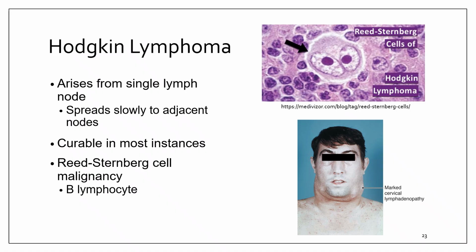Let's zoom in on that histology image. Reed-Sternberg cells are very large, often binucleated or multinucleated, and have prominent nucleoli. Classic appearance is owl eyes. Once you see them, you never unsee them. They look like they know secrets.